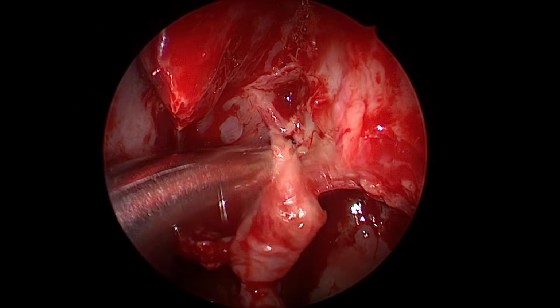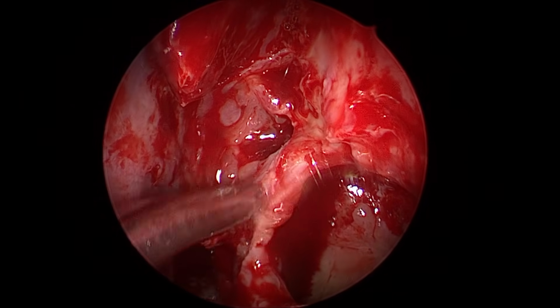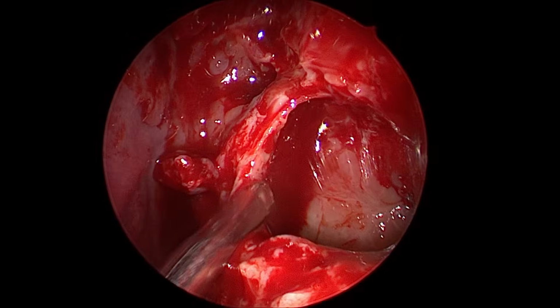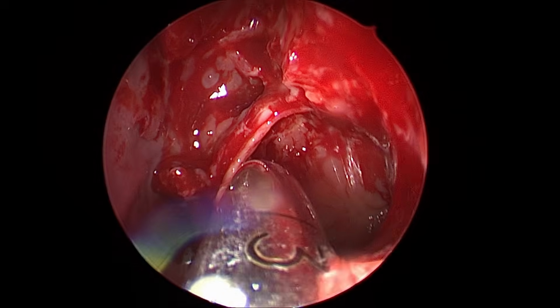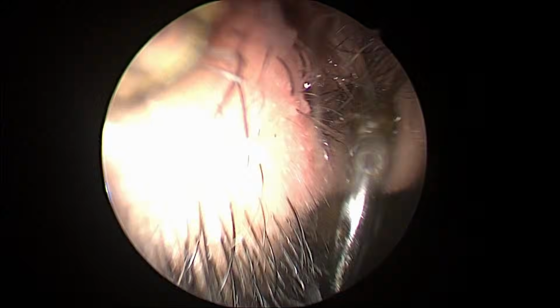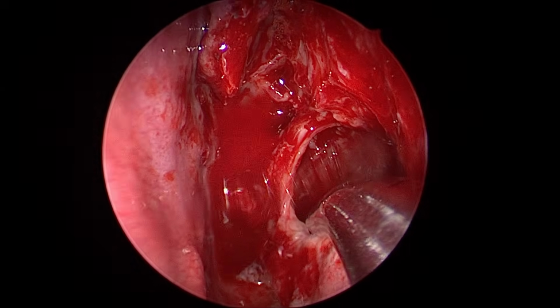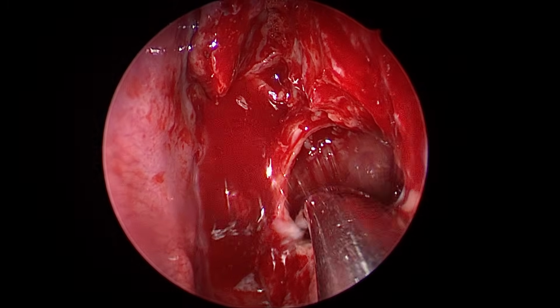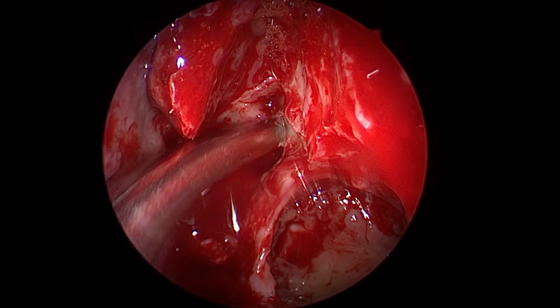See, in a revision situation, you can't take a chance of a second revision. At least your surgical part should be adequately done. See my middle meatal antrostomy now? It should be adequate to penetrate the steroid inside adequately.